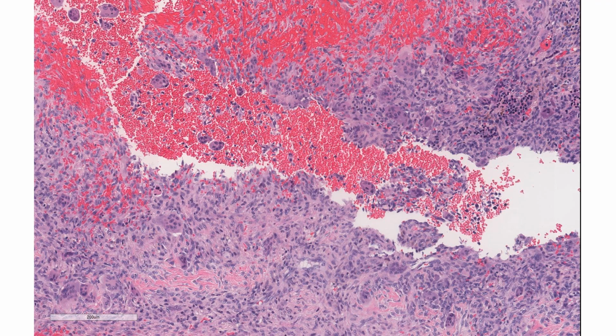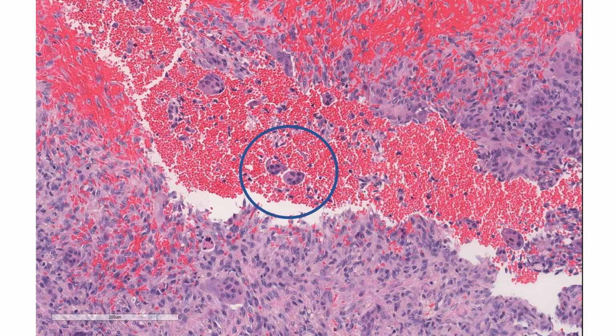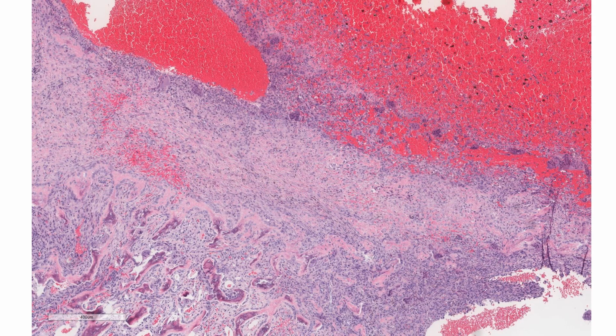This histopathologic H&E slide shows a blood-filled cystic space with fibrous septa composed of cellular proliferation of bland fibroblasts and scattered multinucleated osteoclast-like giant cells. This higher power view shows a blood-filled pseudocystic space and scattered giant cells in the lumen of the cyst, which we sometimes call giant cells jumping into the lake. This is one of the characteristic findings seen in aneurysmal bone cyst. This slide shows reactive woven bone rimmed by osteoblasts in fibrous septa, which has been called blue bone and is also a characteristic finding for aneurysmal bone cyst.